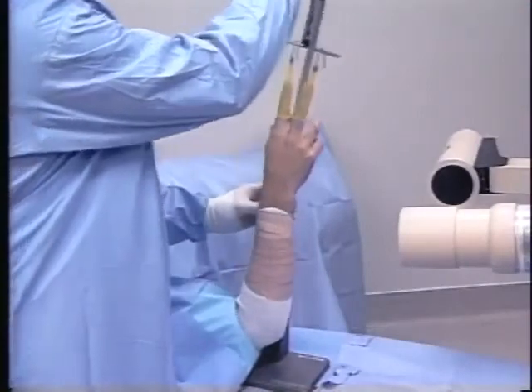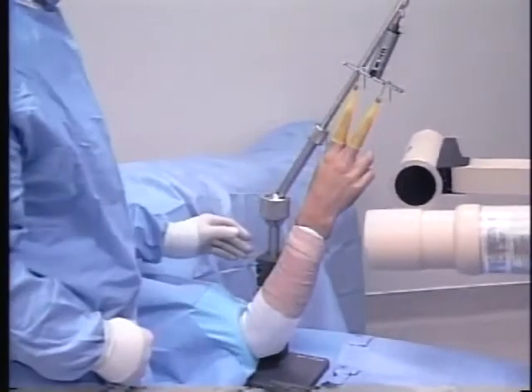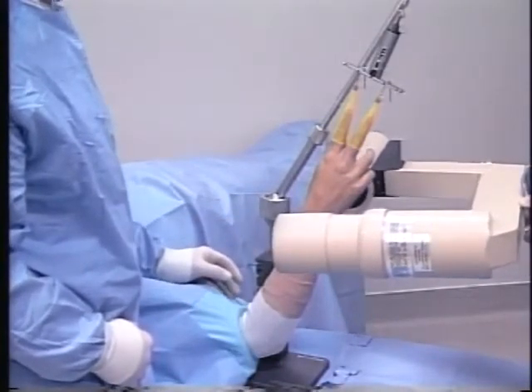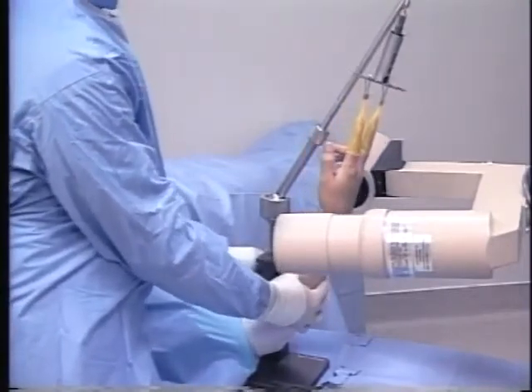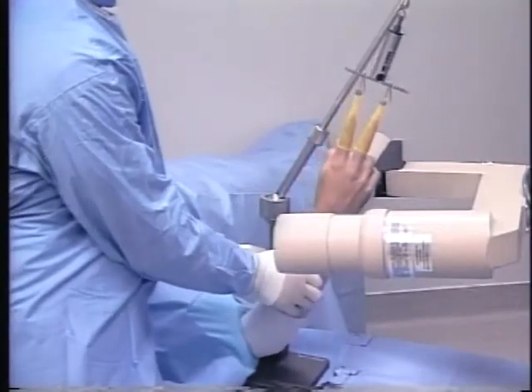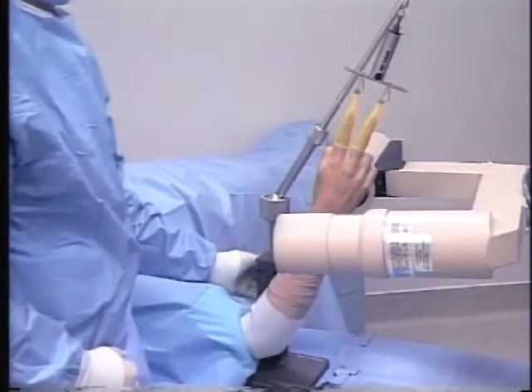To utilize the c-arm type x-ray unit, the forearm strap is removed, the ball joint is loosened, and the upper portion of the traction tower is tilted in either a radial or ulnar direction, then fixed. The c-arm is then moved in place and the x-ray is taken. Either method allows x-ray examination of a repair with the wrist in a normal relaxed position.